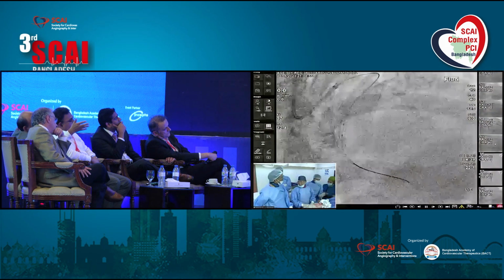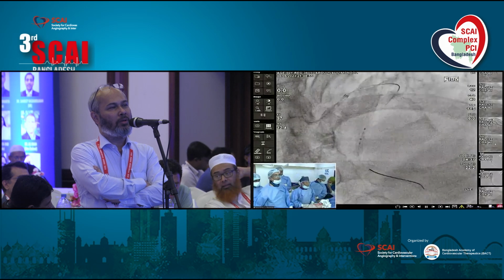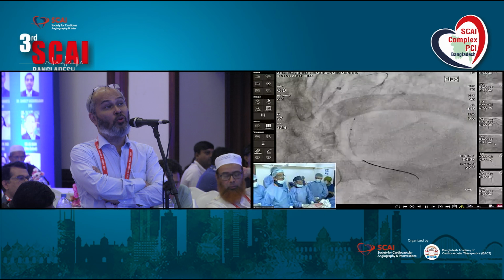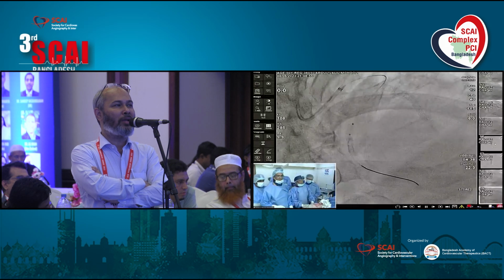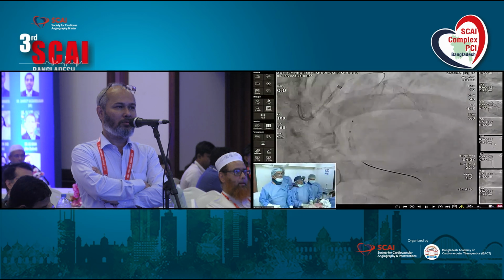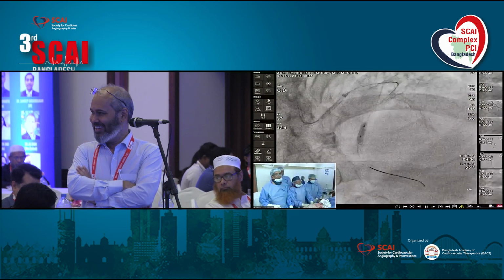You can fluoro. I think, Mir Jamal sir, if you change your views, you will be more happy, because sometimes changing the projection gives you more comfort. So would you like to take any more views from the opposite view? Yes, we can take that.